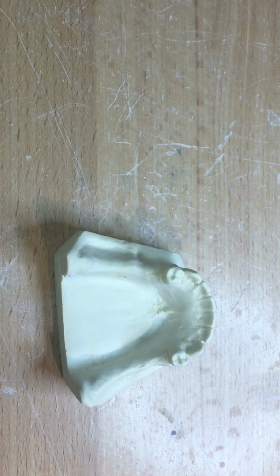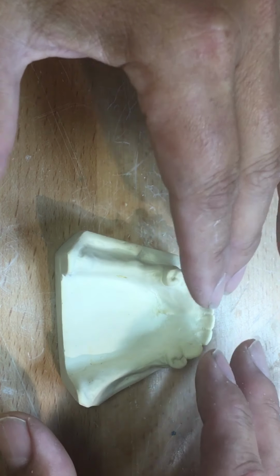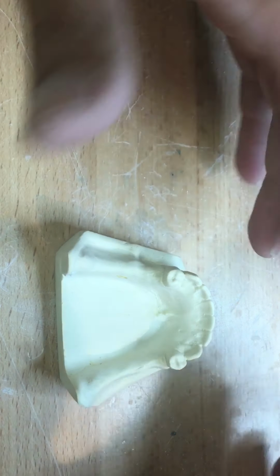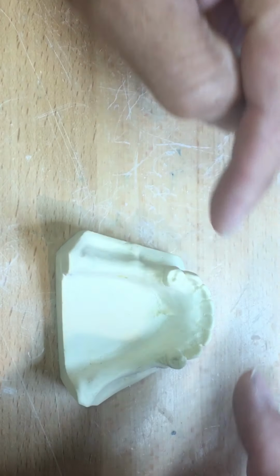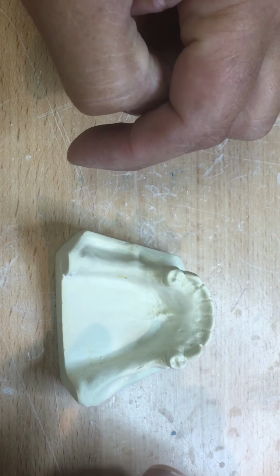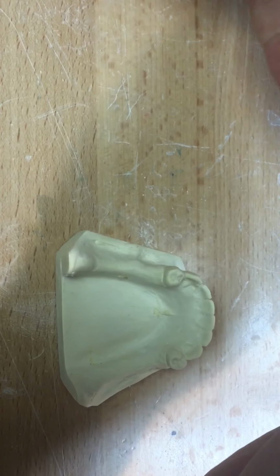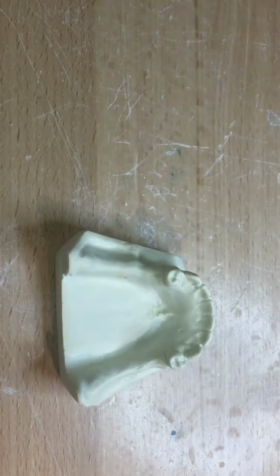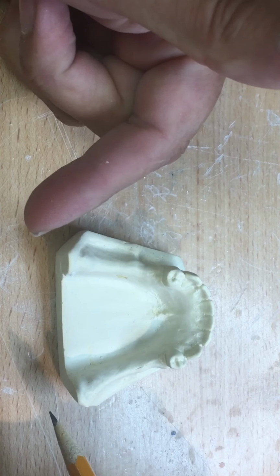So sorry if I confused that issue, but if we have a tooth-to-tooth contact here in the anterior, it would be a centric occlusion record. A full denture on the upper or a big anterior edentulous space partial, then it is a centric relation record where we need to establish group function. Regardless, we're taking a bite registration. Now this bite registration is just in the posterior section.